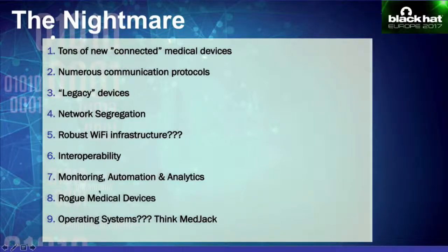And then some of the most common vulnerabilities that we have discovered in these devices are default passwords, hard-coded passwords in firmware, insecure or plain text data during transmission or storage, etc. So just the common vulnerabilities that we have already seen before. And finally, there are medical devices that were never meant to be connected to the network.